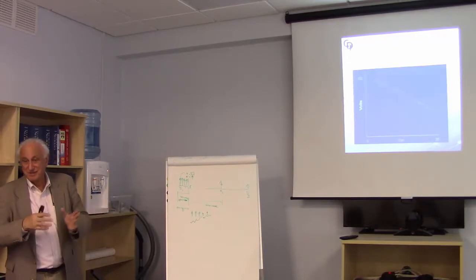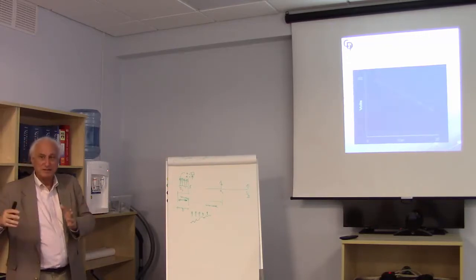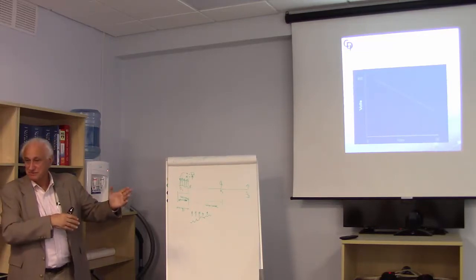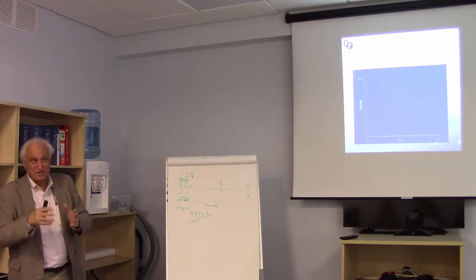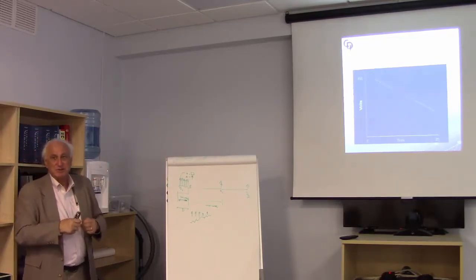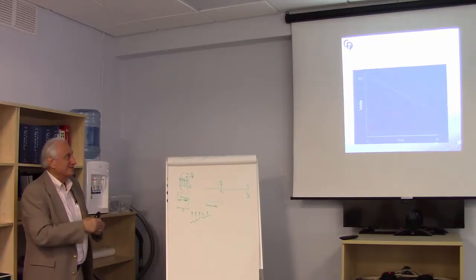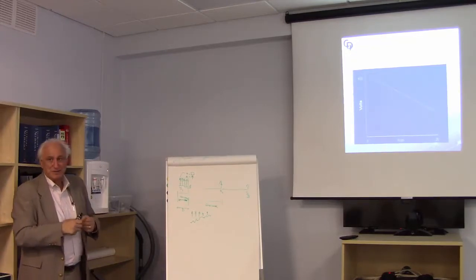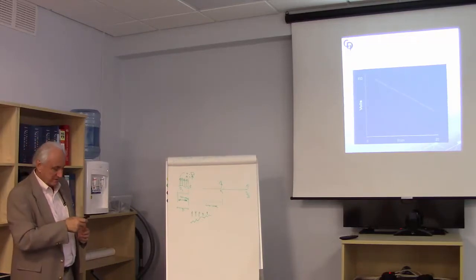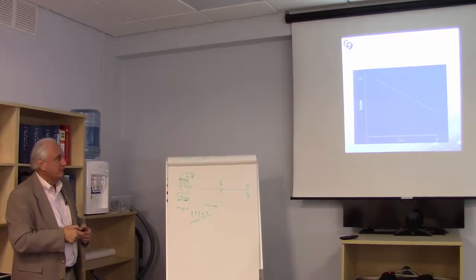So by the time someone gets to 8, 9, 10, they've got a pretty mature response, but early on it's different, and the same thing happens here. So in terms of the operating room, it's more important to understand this about MEPs, because SEPs are not likely to give up.